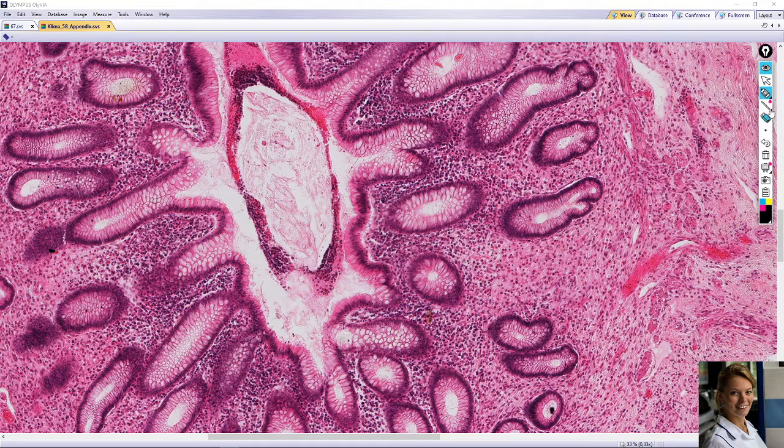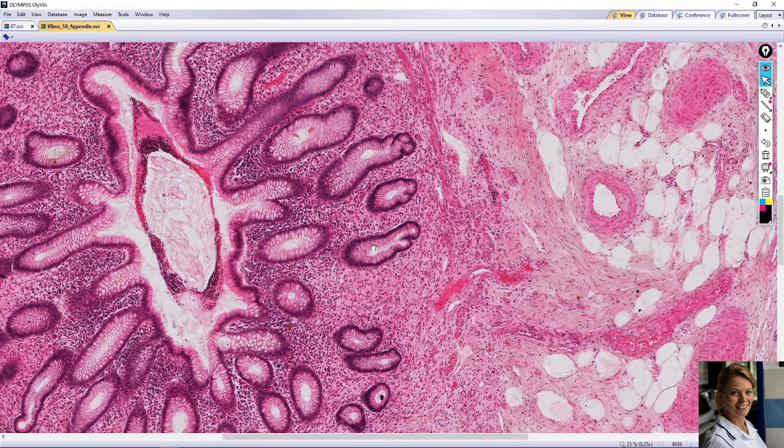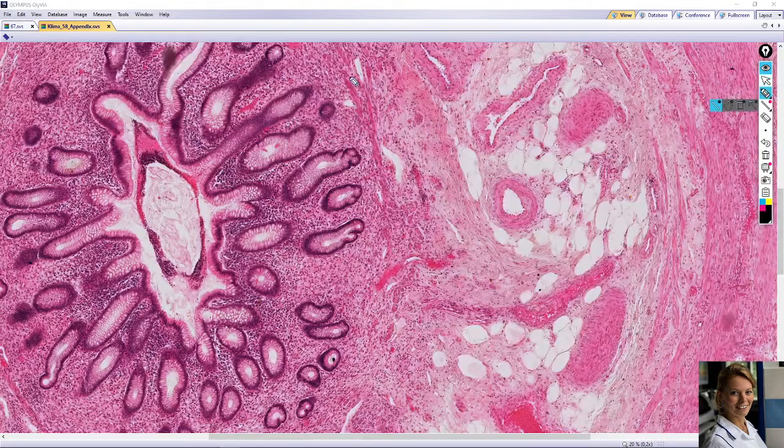Lamina propria contains a lot of lymphoid tissue, but in this slide it is not present, while in the second slide it is abundant. The muscularis mucosae is very often discontinuous because of lymphatic follicles, which may extend into the submucosa. So here it's muscularis mucosae, a very thin layer of smooth muscle cells, but here it's not present.